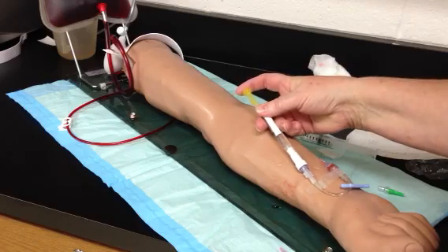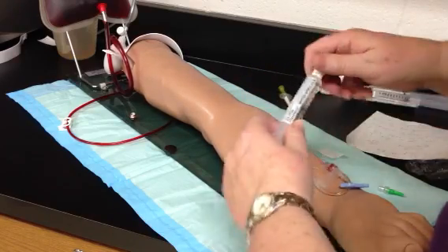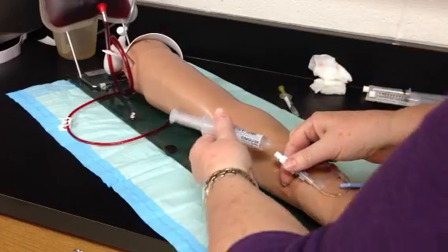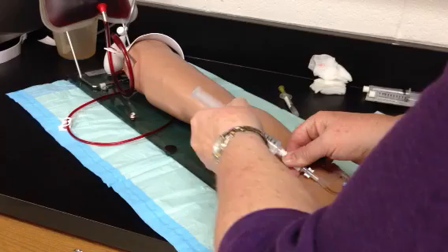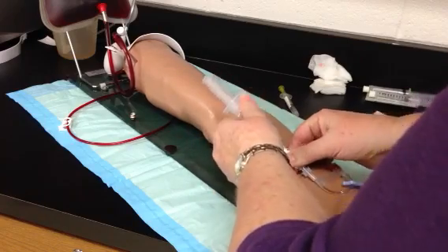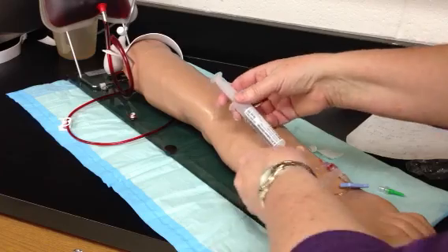Okay, so I'm going to completely push all the medication. This is trash. Take that away and reconnect. And then when I begin to push, I'm going to push at the same rate that I was pushing before.